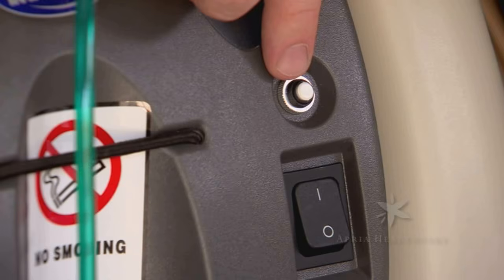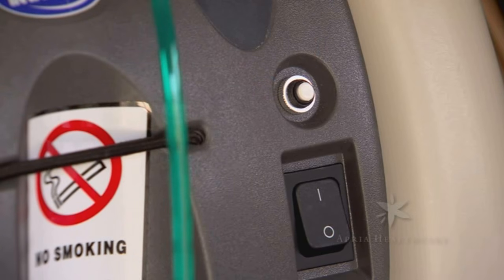If the circuit breaker keeps tripping, check to make sure the concentrator is not plugged into an outlet that is also being used to power other major appliances.